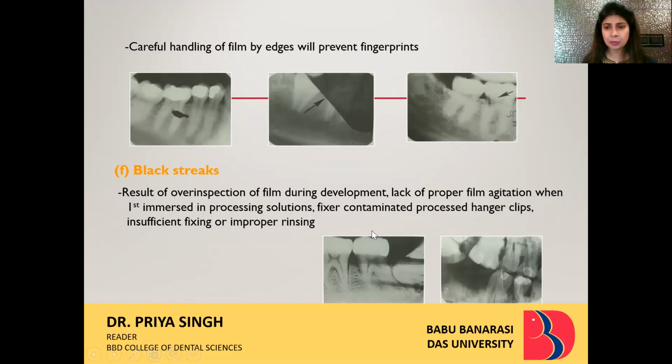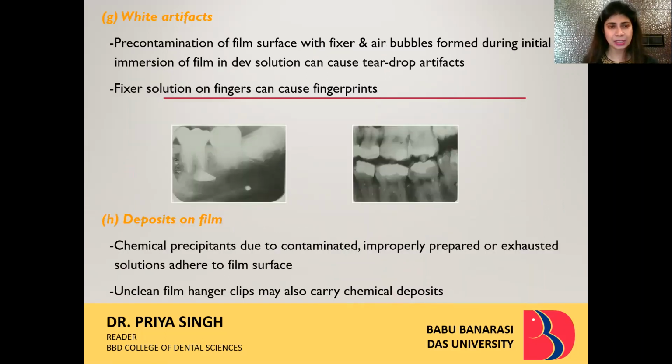Fixer contaminated processed hanger clips, which I have told you earlier also, that the hanger clips should be completely clean before a new IOPA film packet is opened and your image receptor is placed in that particular holder. Insufficient fixing or improper rinsing can also lead to black streaks.